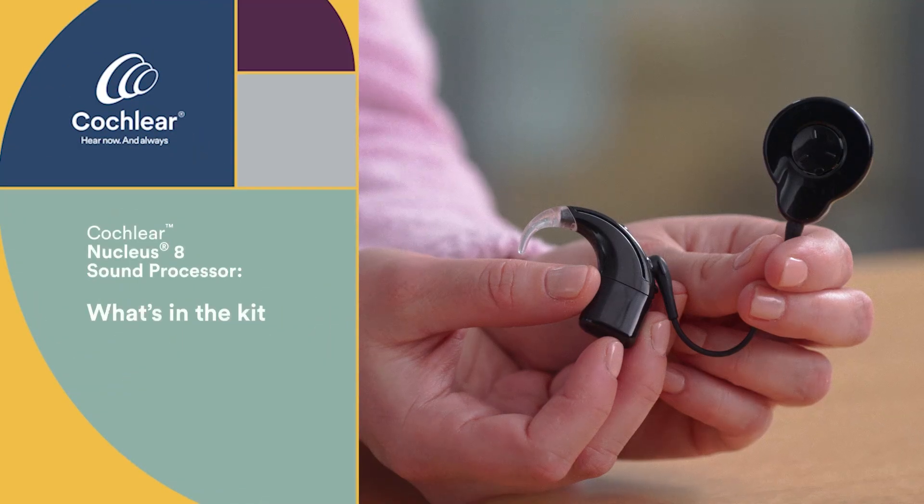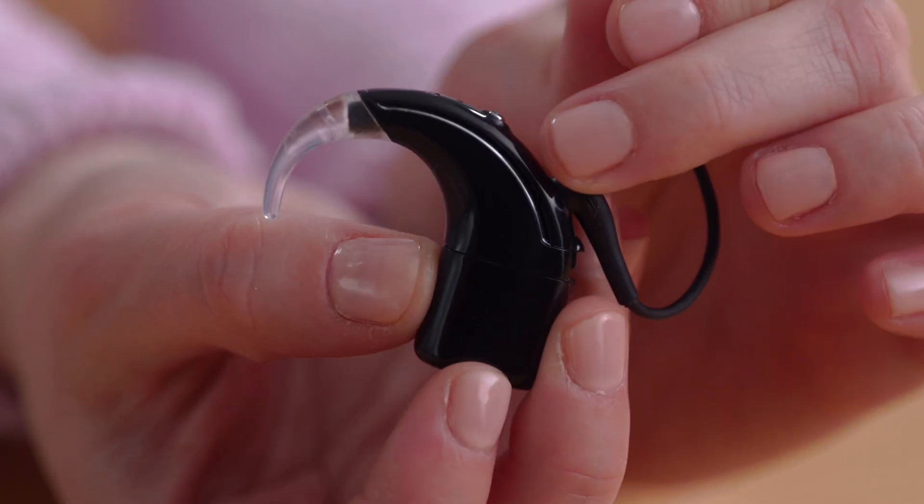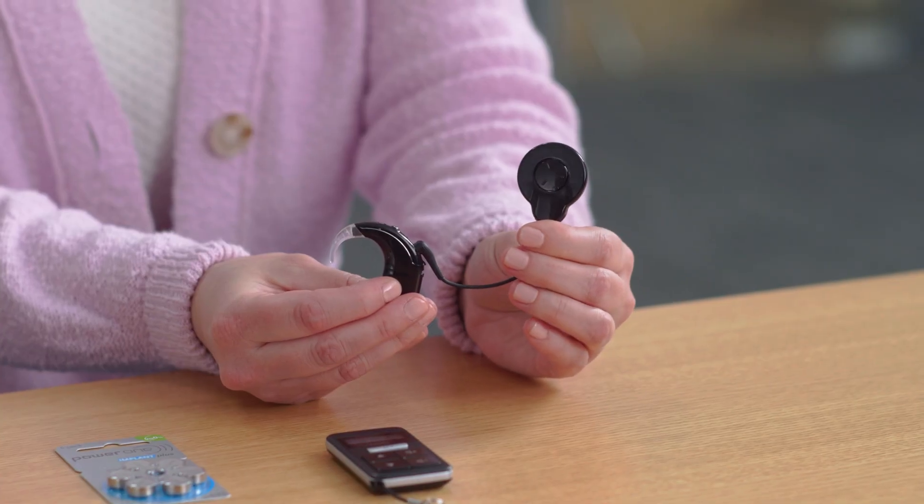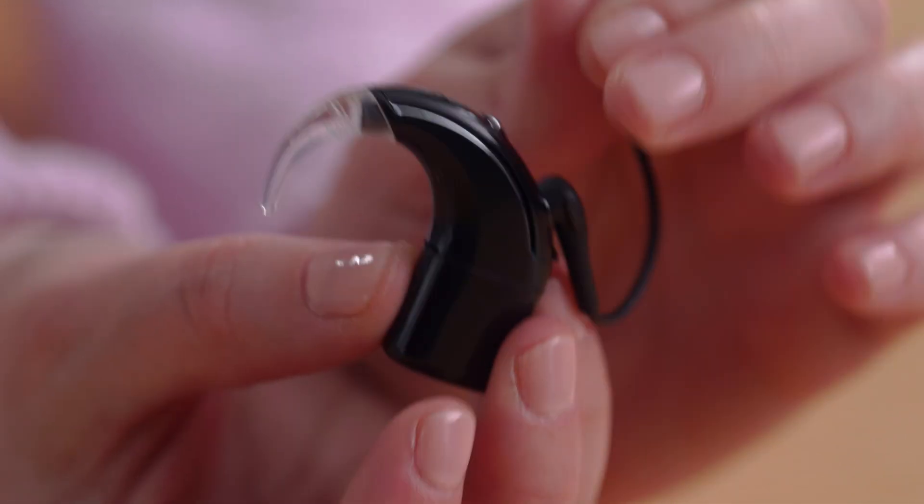Let's start with the Cochlear Nucleus 8 sound processor. It comes in six different colors, including the additional silver option. The Nucleus 8 is designed to be the smallest, lightest, and smartest behind-the-ear sound processor. The core components of the Nucleus 8 are the processing unit, the control button, the coil, the magnet, the battery, and the ear hook.